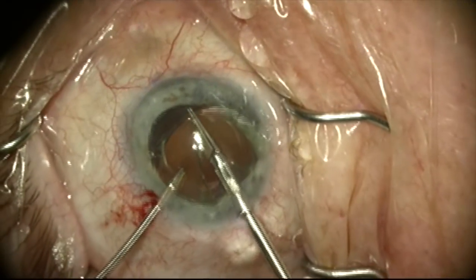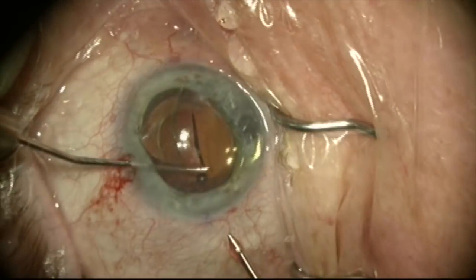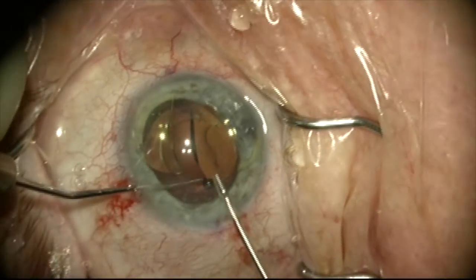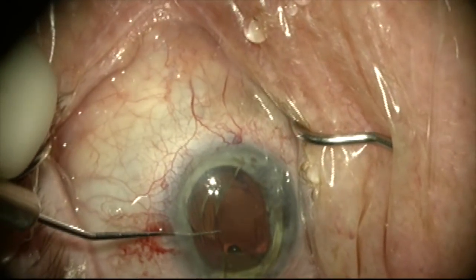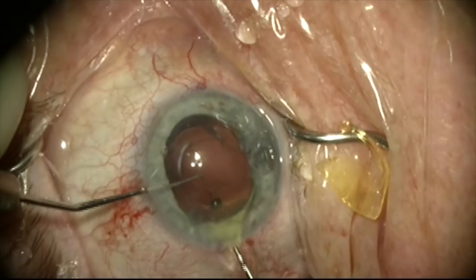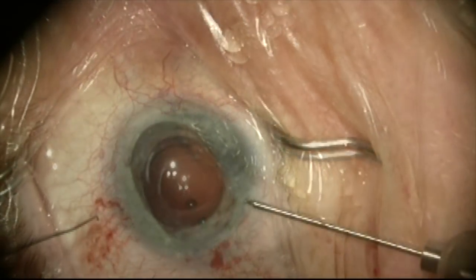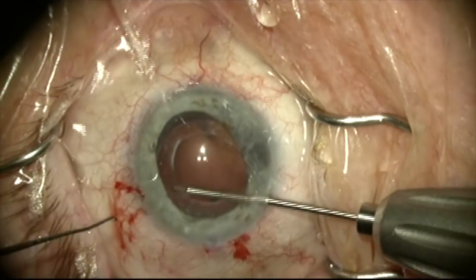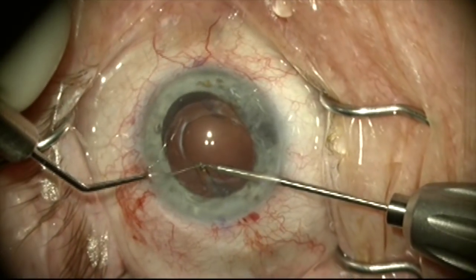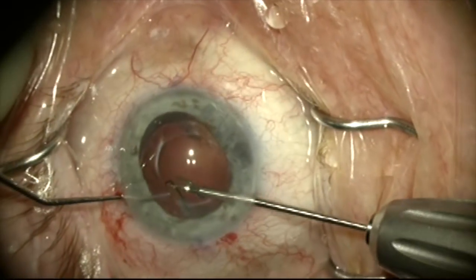The lens will be completely cut in half here and we'll remove each half through the incision. When we remove each half, we'll be careful to protect the corneal endothelium using a Szynski hook. We'll now remove the haptic remnant by grabbing it with a micro grasper and using a Szynski hook to aggressively sweep the fibrosis off the tip of the haptic.